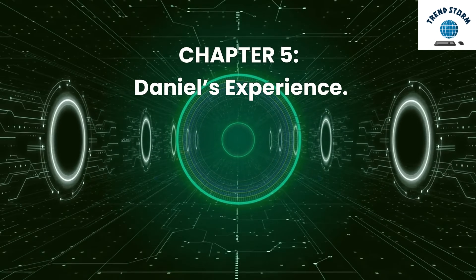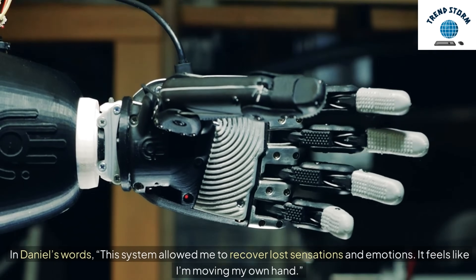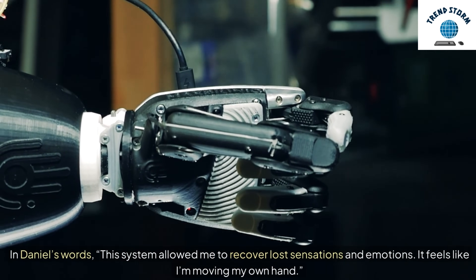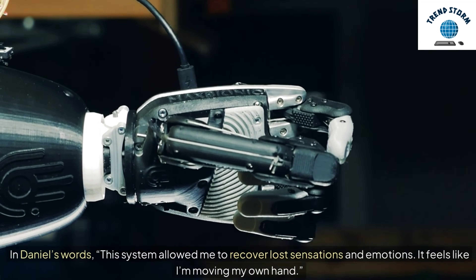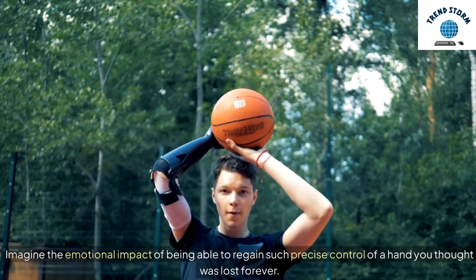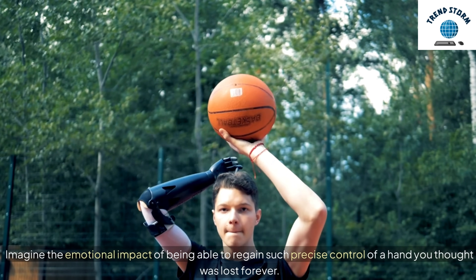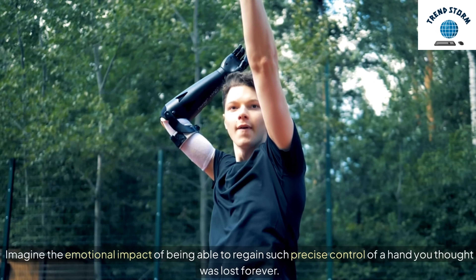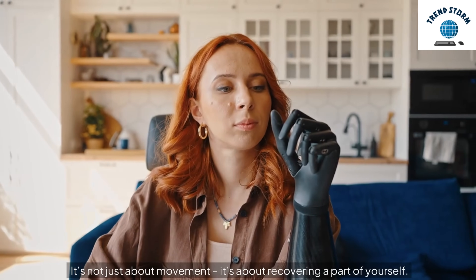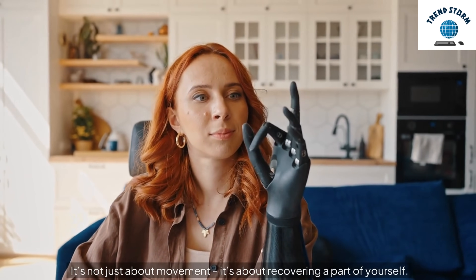In Daniel's words, this system allowed me to recover lost sensations and emotions. It feels like I'm moving my own hand. Imagine the emotional impact of being able to regain such precise control of a hand you thought was lost forever. It's not just about movement — it's about recovering a part of yourself.